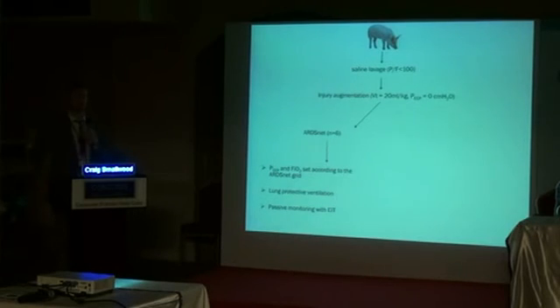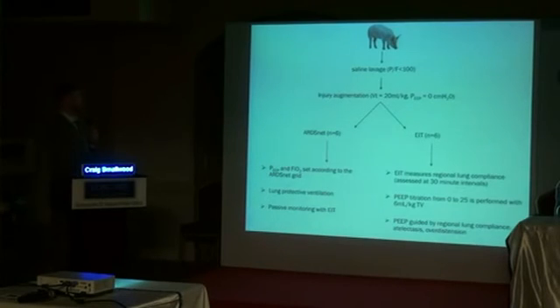You just overdistend, tidal recruit, try to rip those alveoli apart as much as possible to induce injury. And so we had some animals that we used by ARDSNet, so small tidal volumes and a PEEP FiO2 grid. That was the standard protocol, and we just passively also monitored EIT. And then with our EIT images, we took regional lung compliance every 30 minutes. So the whole protocol lasted 6 hours in total during ventilation.